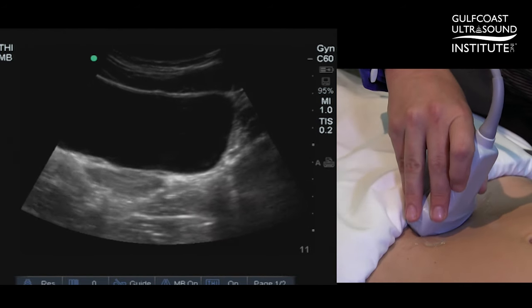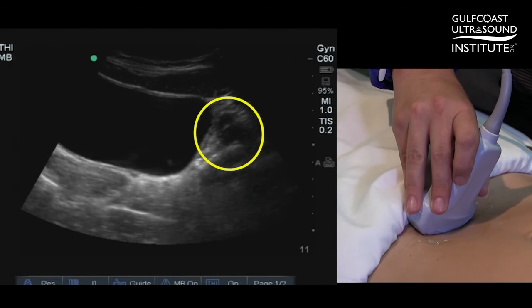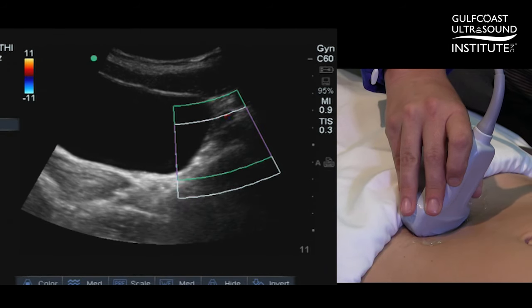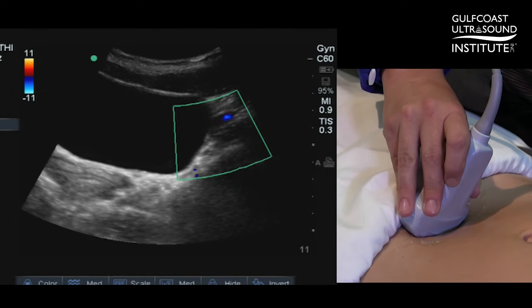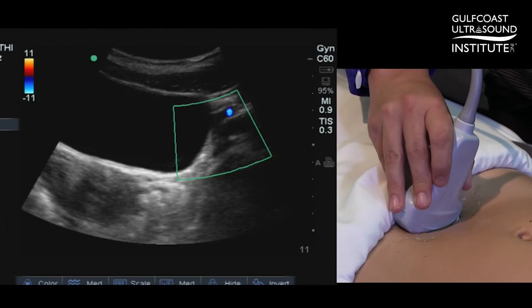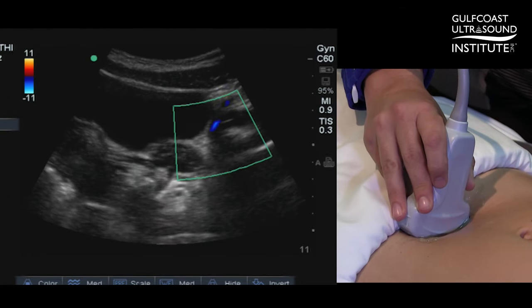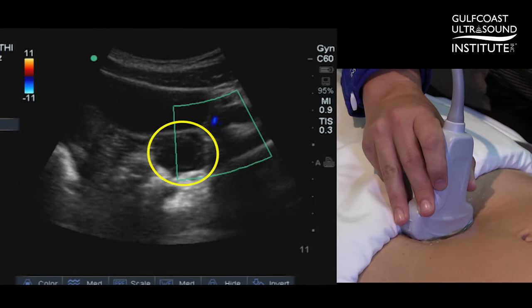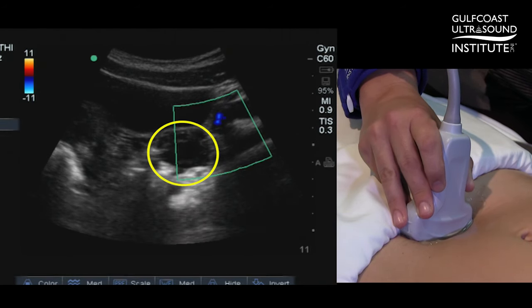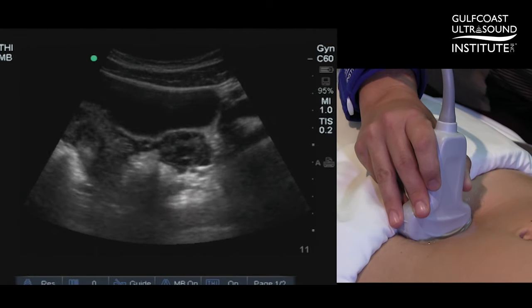I'm going to be pivoting the energy towards my patient's left side where I can identify the iliac vessels in 2D. Now I'm going to place color on and then use them to guide me as I slowly angle superiorly, watching as these neon lights dive just lateral to the ovary on most patients.